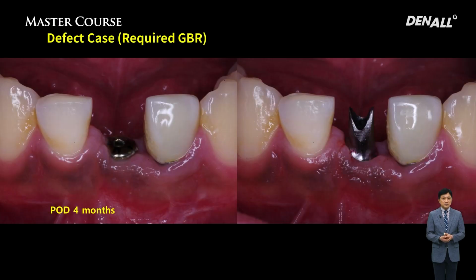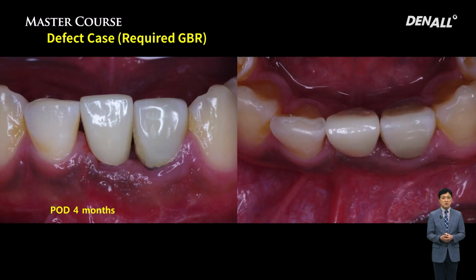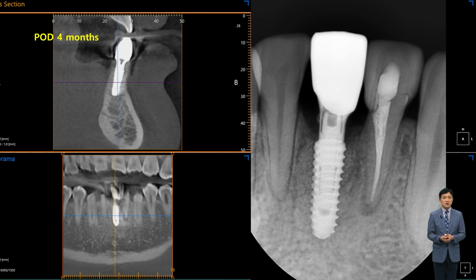Post-op 4 months, the prostheses were delivered. At the time of prosthesis delivery, we took a CT view and periapical view.